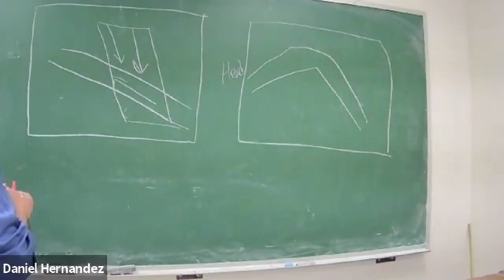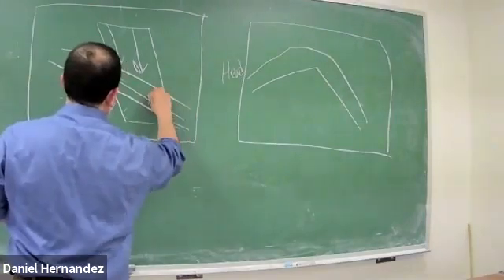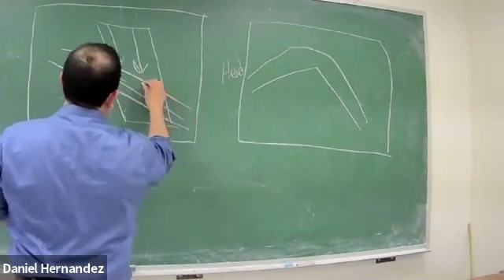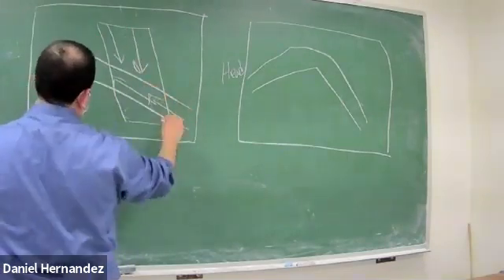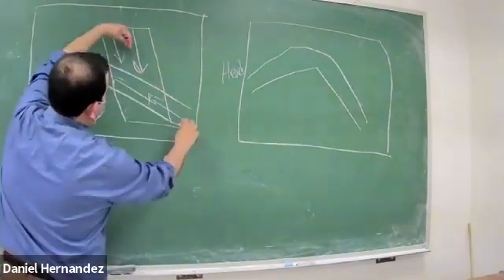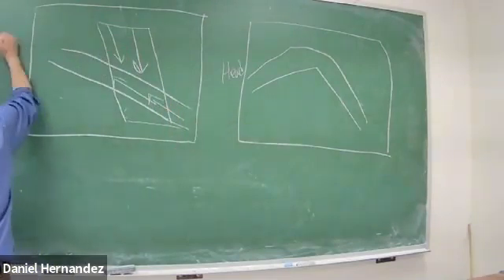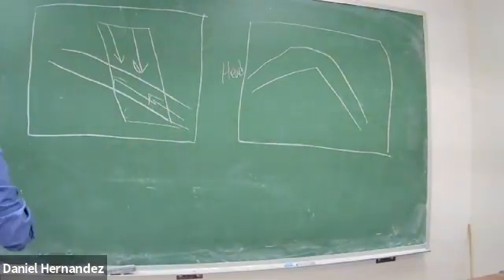So in terms of flow direction, if blood flow is coming up the vessel this way, this blood flow is headed towards our ultrasound beam. They're coming at each other, so that's going to create a positive Doppler shift.